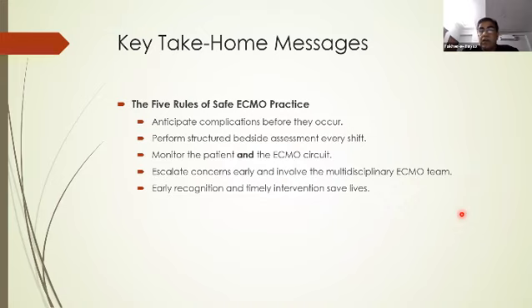Anticipate complications before they occur. Perform a structured bedside assessment every shift. Monitor the patient and the ECMO circuit. So we have to look at both, the patient as well as the ECMO circuit. Escalate concerns early and involve the multidisciplinary ECMO team. And then, early recognition and timely intervention saves life.